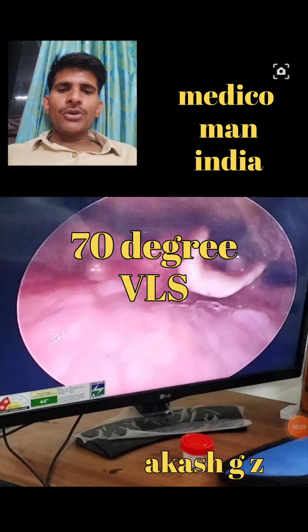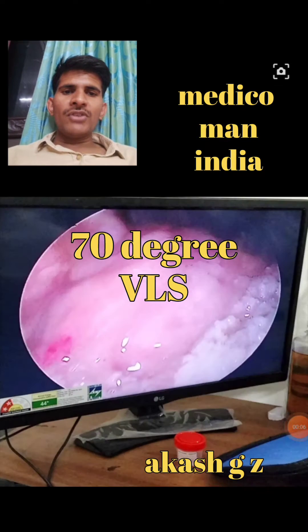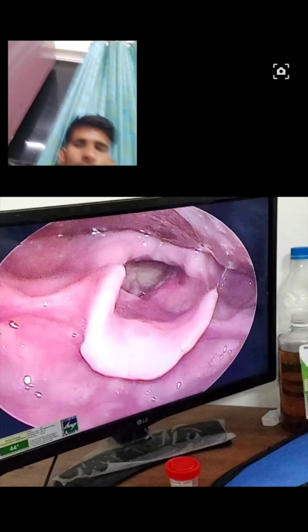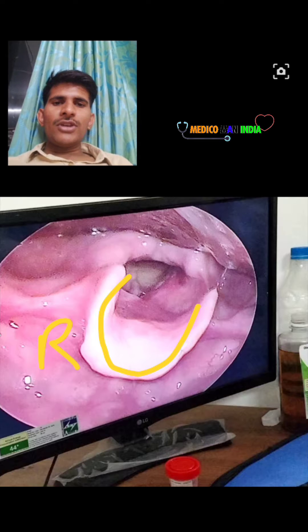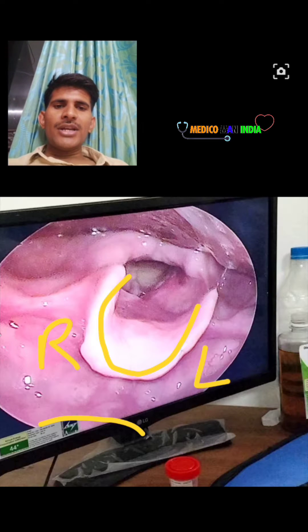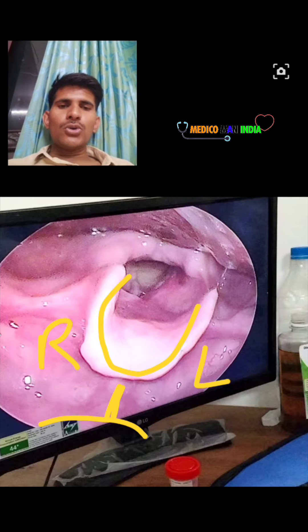Here we are doing a 70-degree video laryngoscopy. As we put the endoscope in and move inward, you can see the base of the tongue. Moving forward, this is the epiglottis cartilage. Here is the right side vallecula and the left side vallecula, and this is the base of the tongue. Here is the median glossoepiglottic fold.